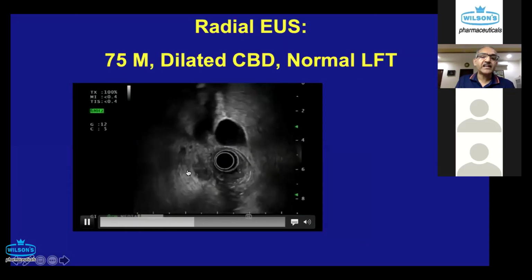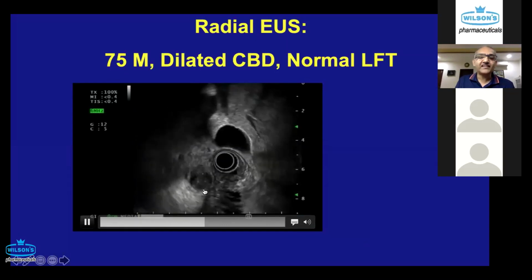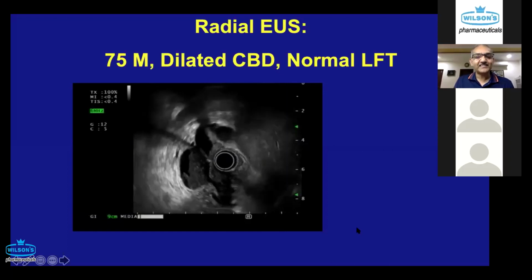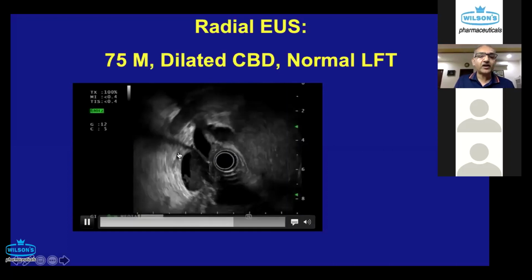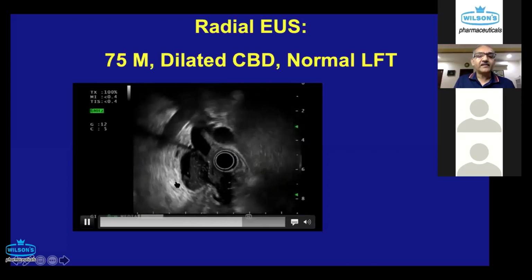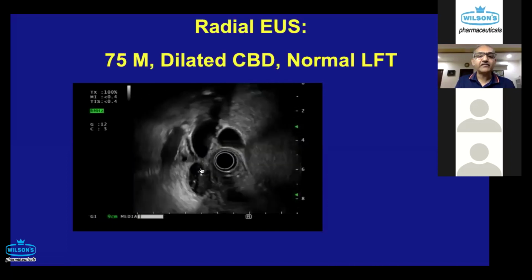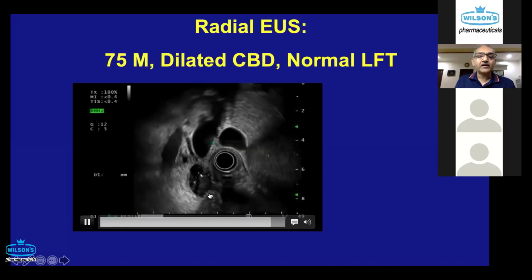Before I give an answer, I want guesses from people. You can put it on the chat box also. That's a pancreas behind a normal pancreatic duct. And Gyas and Saad would, I'm sure, already have diagnosed it. This is a large periampullary diverticulum. So the trick over here is that you put water in the duodenum, if you're not able to find what's happening in the lower part of the CBD, and it's not looking like a classical tumor or a stone.